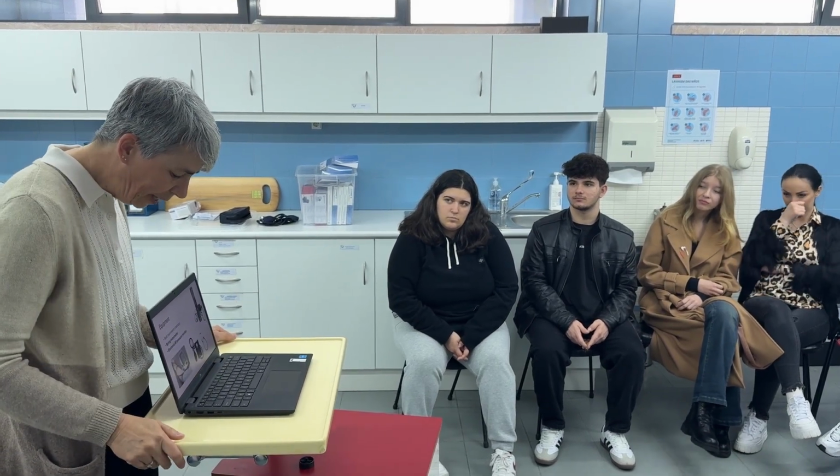So here is the one we might not really like a lot, but it's also a very good way. It's what we call, I don't really know how it's translated, spring manometer. So it's just this kind of manometer, what we call like that. These two we use a lot. This one is not in use anymore, but it still exists. And we are going to do it with this: the manual blood pressure measuring.